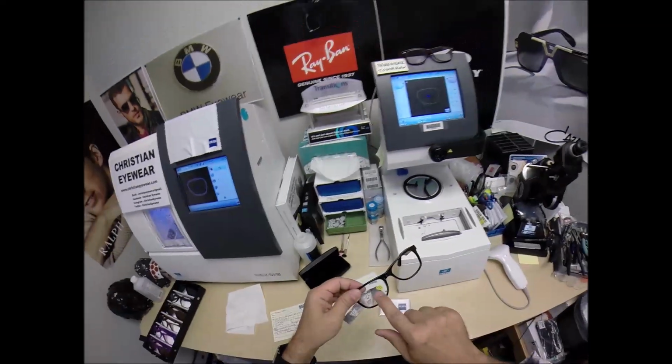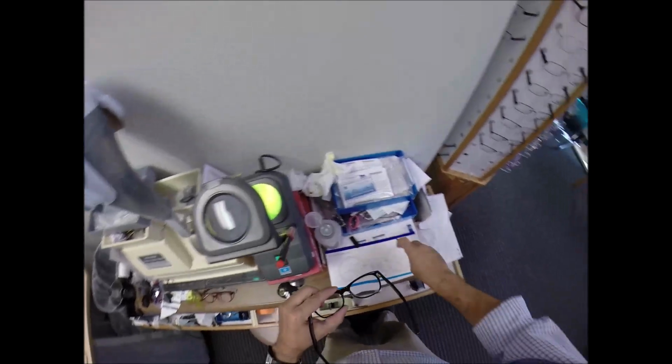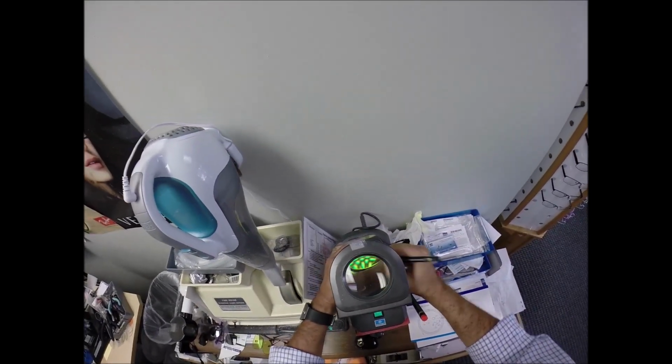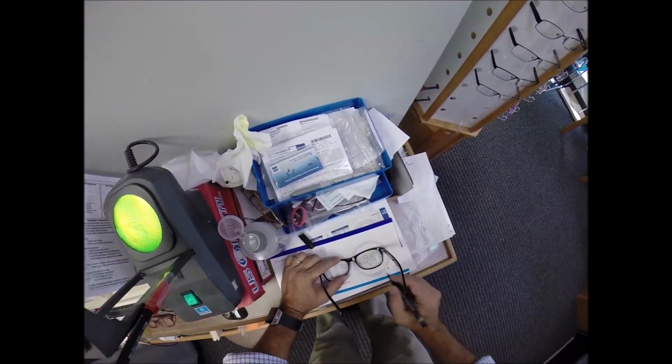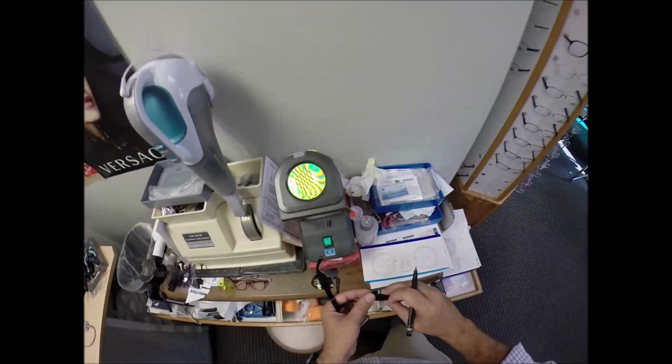Now, this is where I would do the final inspection, but one of my dots is worn off, so I'm going to come back down here, make sure all the dots are in the right place. Progressives have a layout chart. I'm putting that on the Zeiss chart. And now that dot is going to sit directly in front of my pupil.